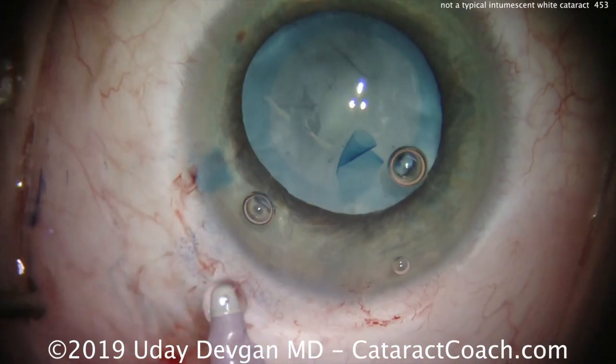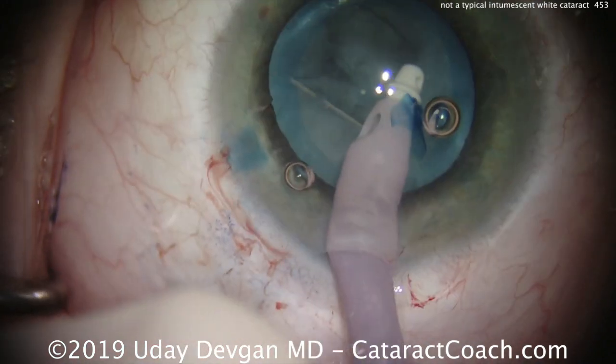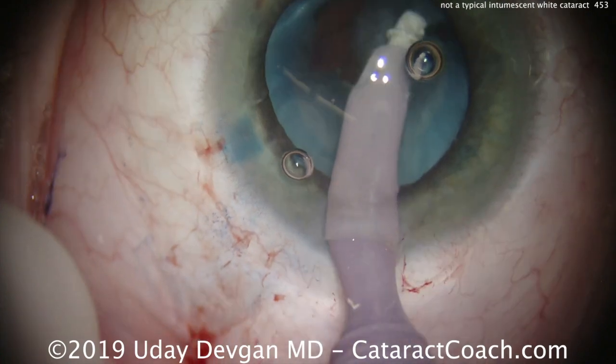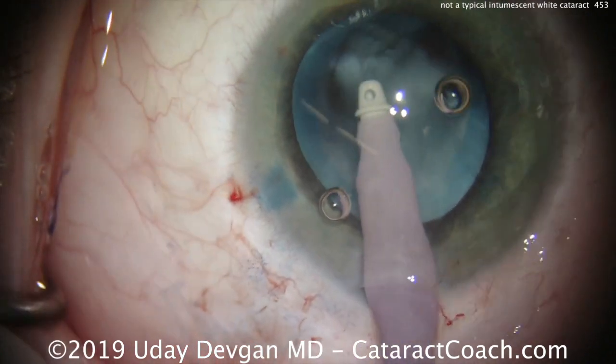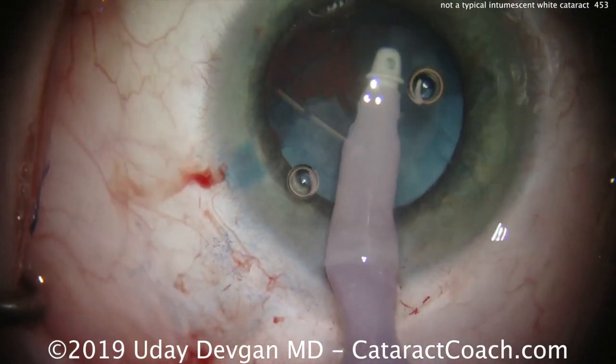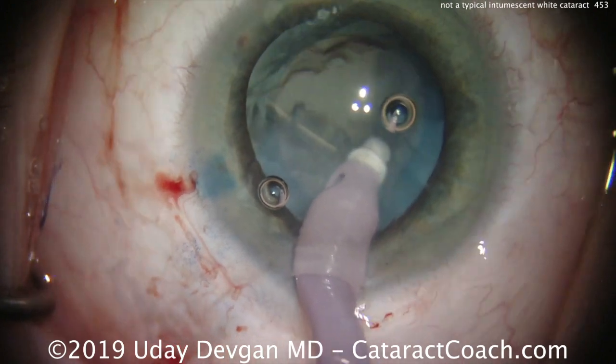And so we can try to clean up a little bit here. We'll clean up and put the lens in. Now, I actually knew this was going to happen, and we have our vitreoretinal colleague scrubbed into the surgery with me. I don't have the same skill sets as Lukan. Lukan does anterior, posterior, anything he'll do. That's amazing, I'm very jealous.